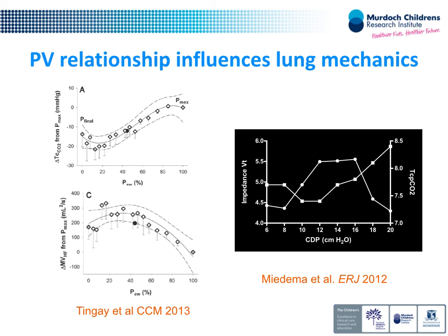So I think having them running at once is a good thing. But because they're pretty crude markers, I tend to have them all running. And when I do this, I'm writing all of my numbers down. Every step: mean airway pressure step, FiO2, saturation, heart rate, blood pressure, DCO2, all of that, every step. Firstly, because I can't remember what happened, and secondly, it then allows me to work it all out and know what I'm doing.